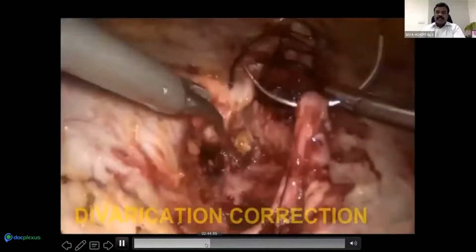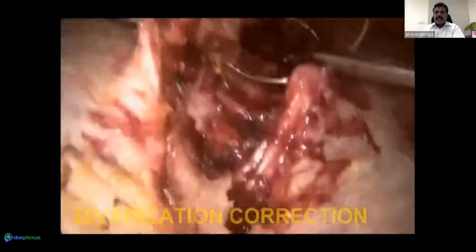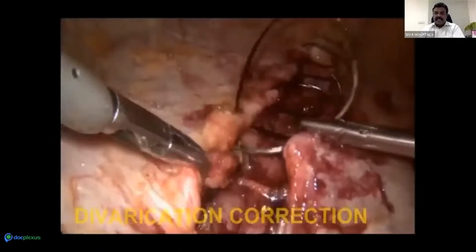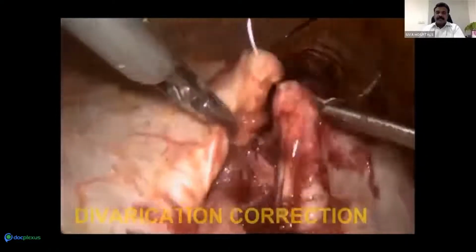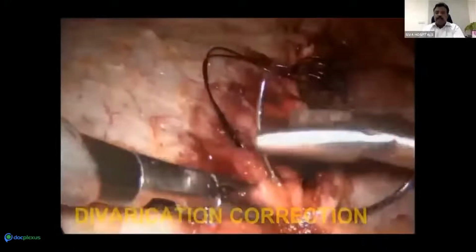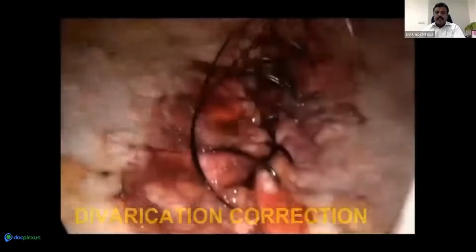So you can see now I'm just trying to tighten it a little bit. You can see the lax diastasis of the rectus. This can be carried out up to the pubic symphysis, if your camera person is very good.